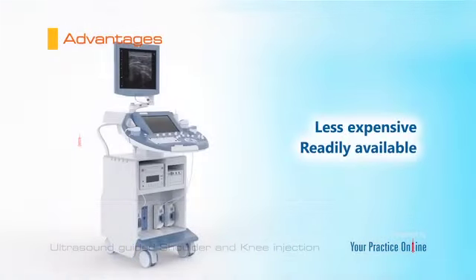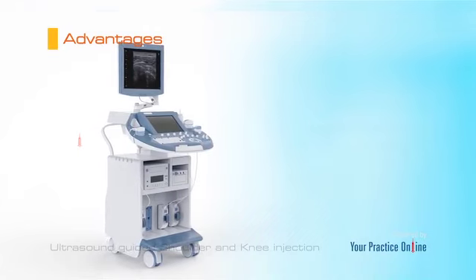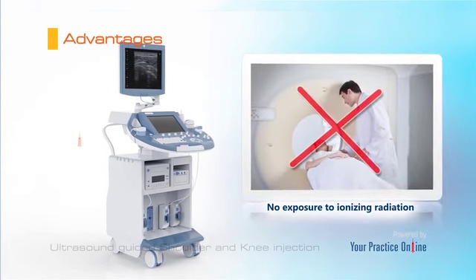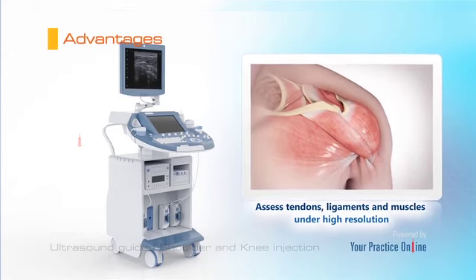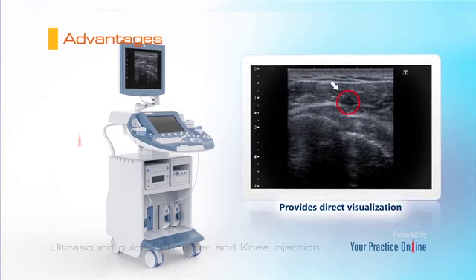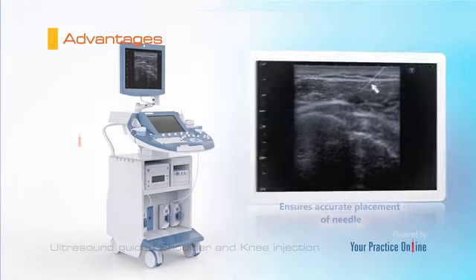Advantages. The advantages of ultrasound imaging compared to other imaging techniques include the following. No patient exposure to ionizing radiation. Able to assess tendons, ligaments, and muscles under high resolution. Provides direct visualization of the area being treated. Ensures accurate placement of the needle to targeted areas.